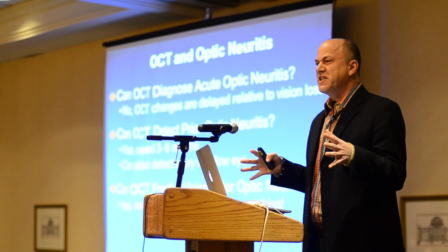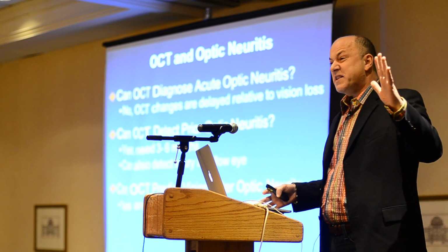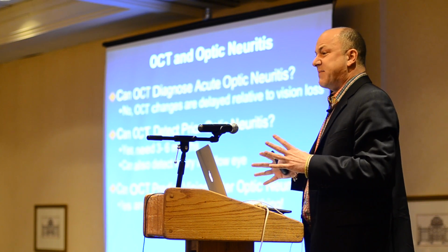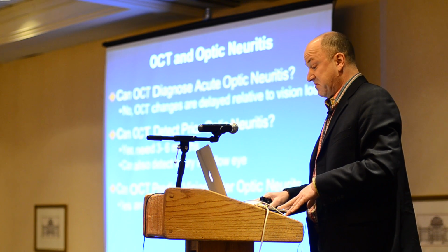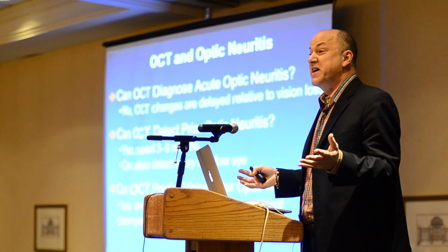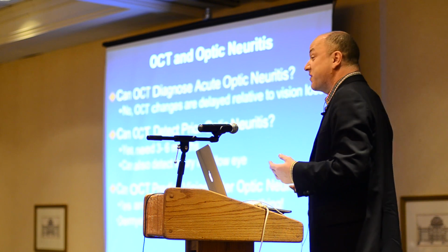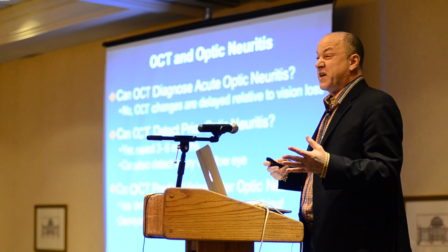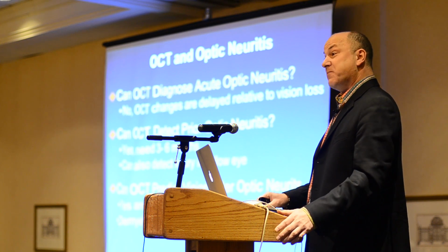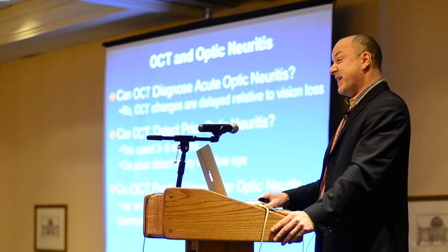Because axon loss is not everything. As I showed you, axon loss can predict the amount of vision, but the extent and even the region that's affected isn't this one-to-one relationship that's absolutely perfect. And that's because white matter injury also stinks, okay? It's not good to delay your transmission and to interrupt that transmission back to the brain. And so both of these factors contribute. And if you look at the amount of information overall that OCT provides, it maybe is about 30 to 40% of the overall information to explain your vision loss. It correlates, but it's not everything.